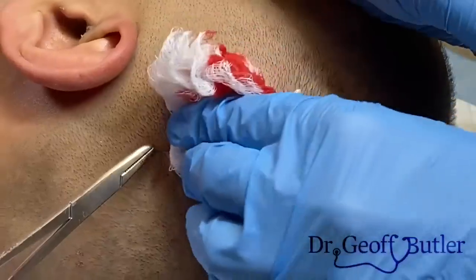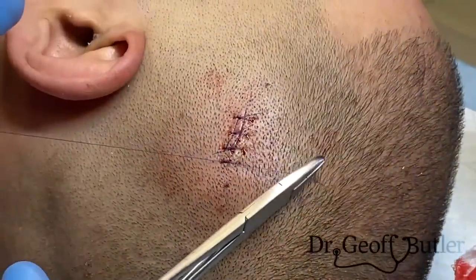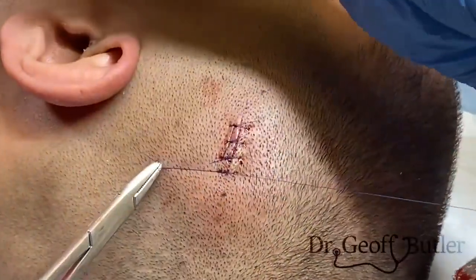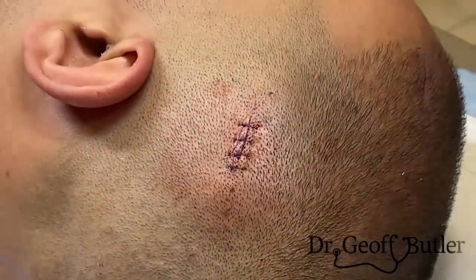Just have that for me. Almost done. Right there. So that looks nice and clean. We'll just clean that up and put a dressing on him and he should be fine.